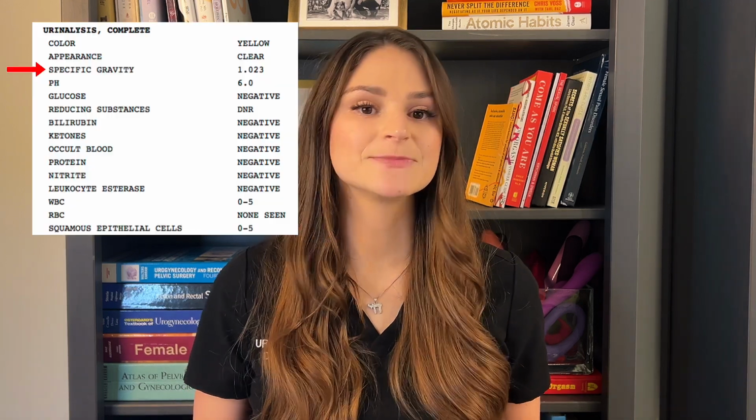The next item is specific gravity. It basically means how concentrated your urine is. The higher the number, the more concentrated urine is. So you're probably a little dehydrated and you should drink a little bit more fluid. Or if the number is low, you can cut back on the fluid.